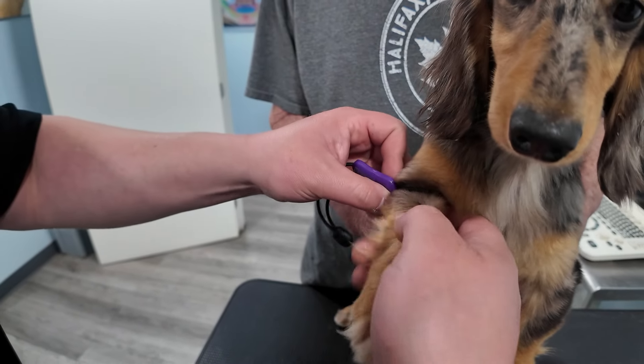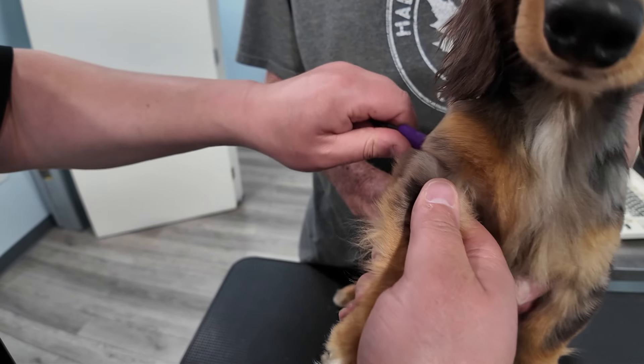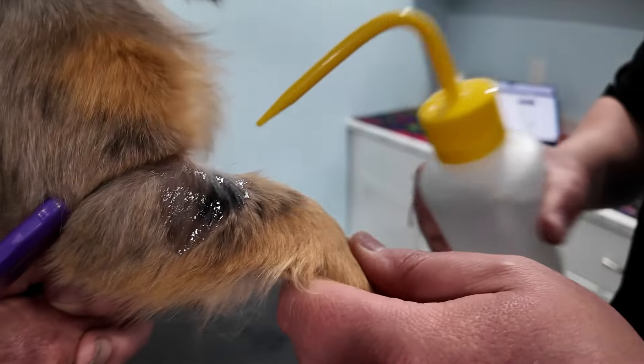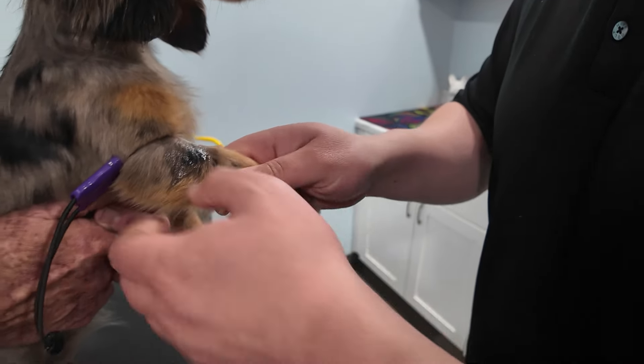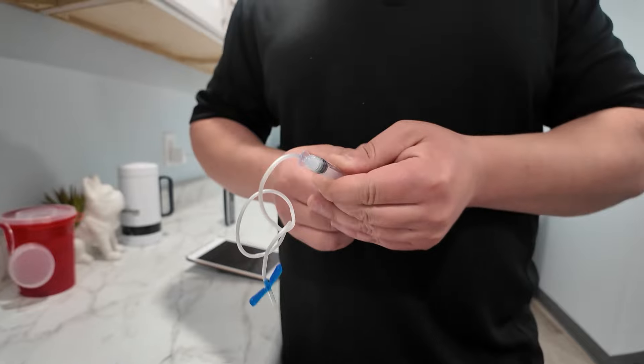To begin drawing blood from a dachshund, we start by applying a small adjustable tourniquet to the dog's leg. This helps to engorge the vein, making it easier to locate. Next, we thoroughly clean the injection site with alcohol to ensure it is sanitized.